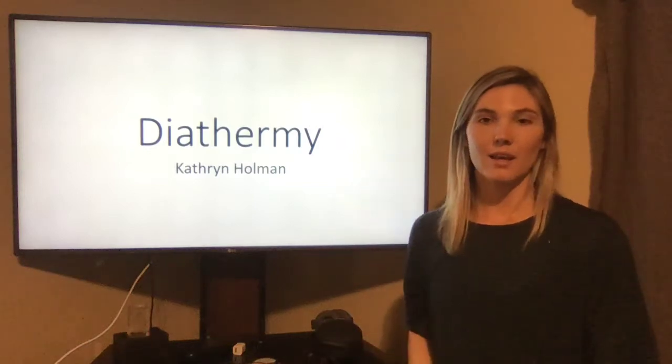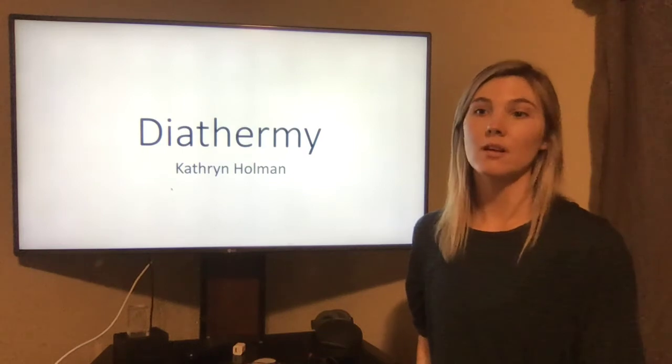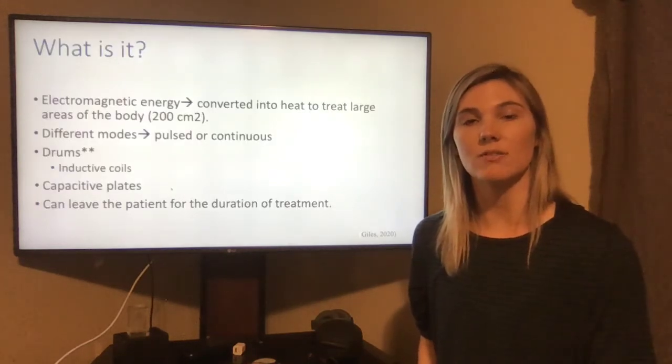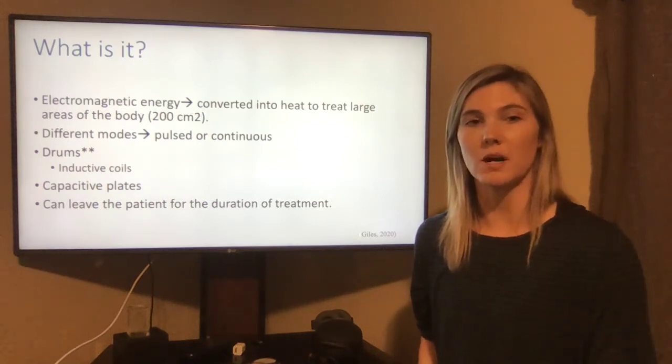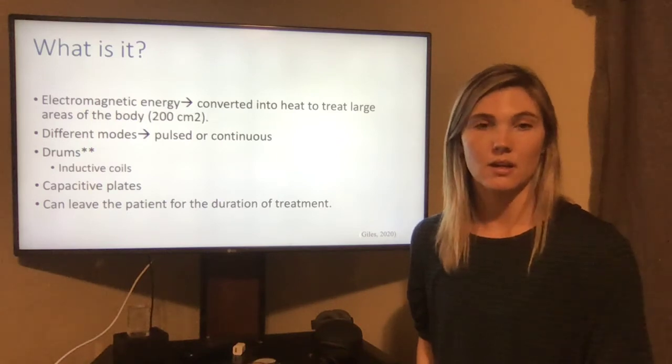Hey y'all, I'm going to be doing my presentation on diathermy. Diathermy is a modality that utilizes electromagnetic energy. It converts that energy into heat to treat large areas of the body. So it's using conversion, so no direct contact is needed.